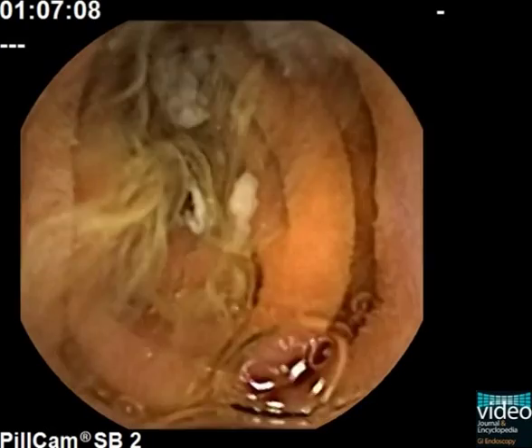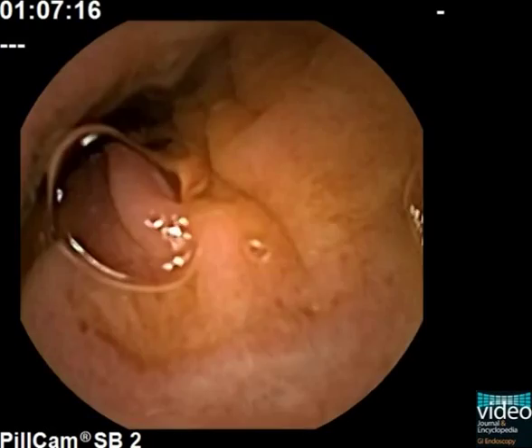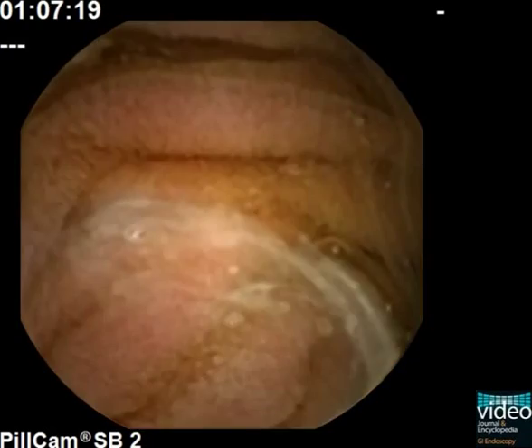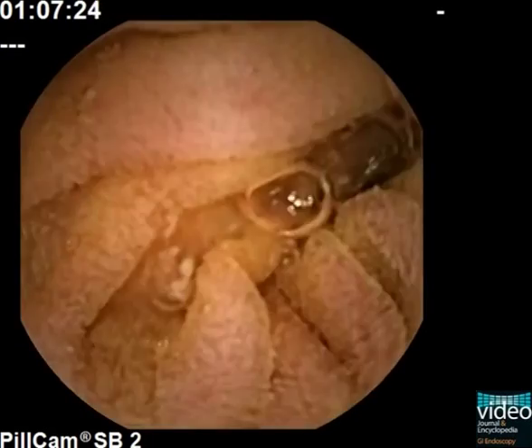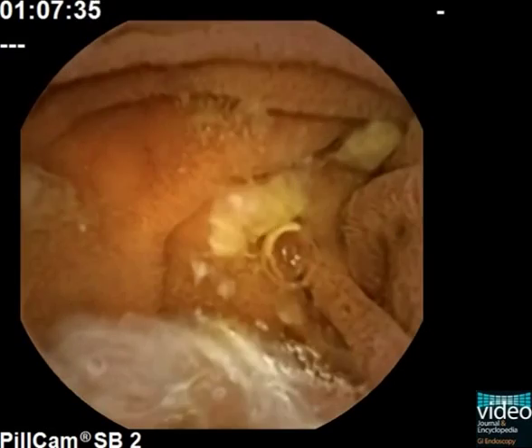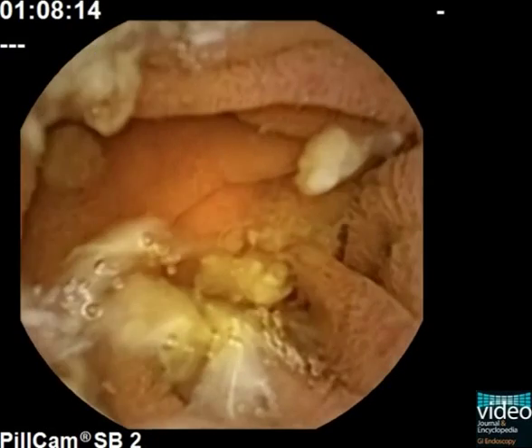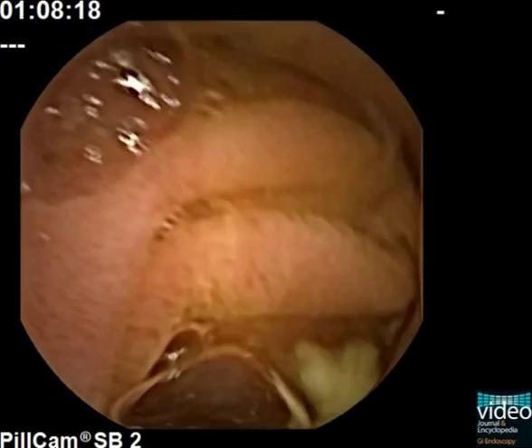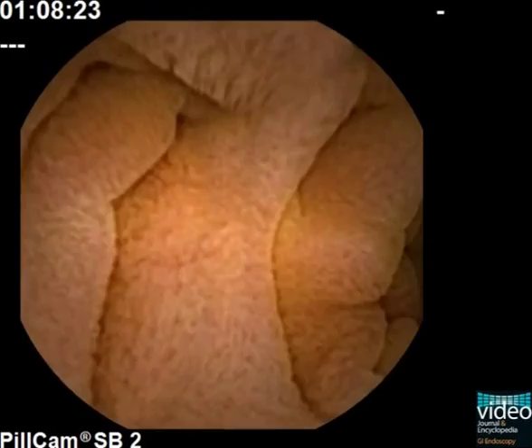Passing the pylorus, the capsule takes a quick course through the duodenal bulb and the descending duodenum. The papilla of Vater is sometimes concealed by luminal contents such as bile and may be missed in a quick duodenal passage of the capsule.